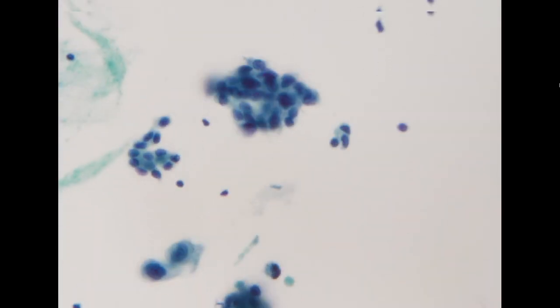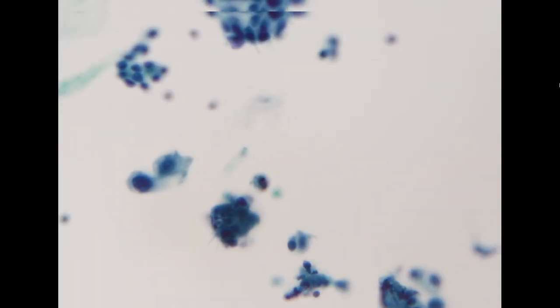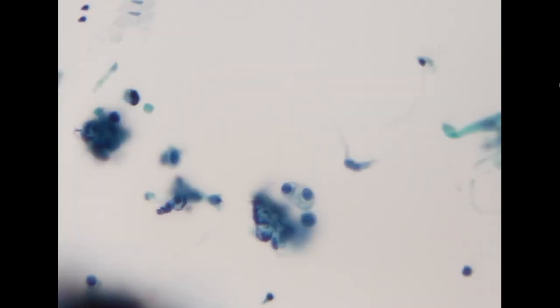When we go to higher power, these cells do show hyperchromasia, coarse chromatin, increased N/C ratio, and a lot of them show a squamoid type of morphologic pattern. So these cells look kind of squamoid in an elder female.